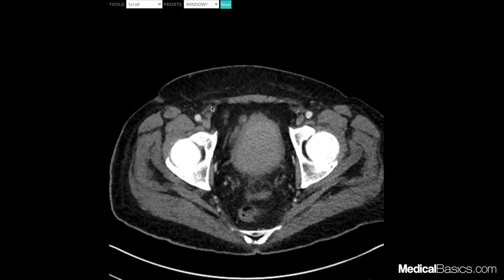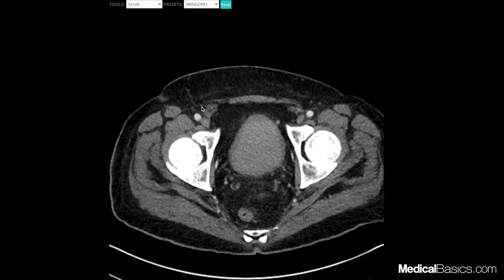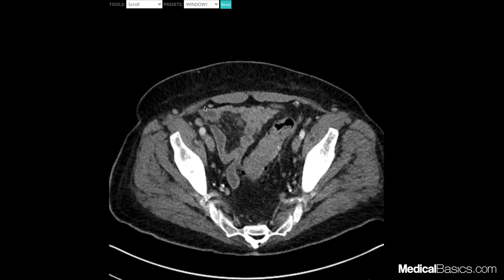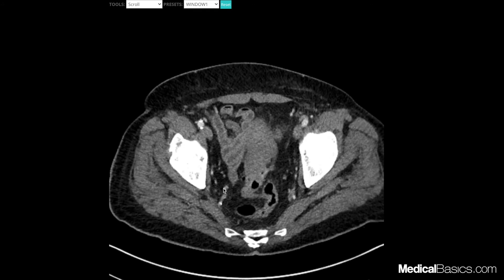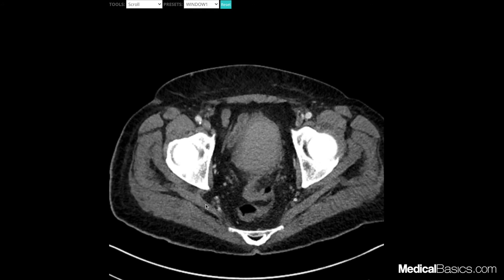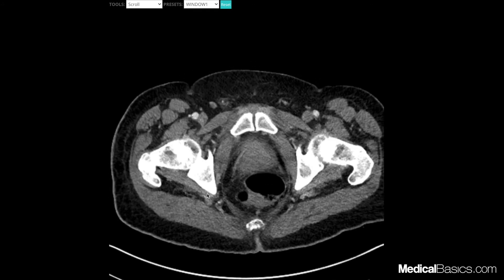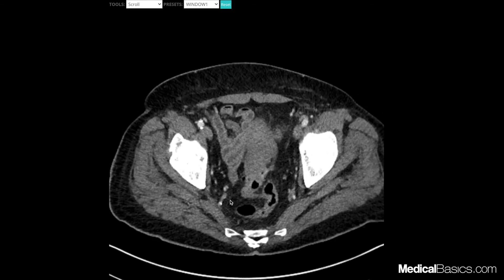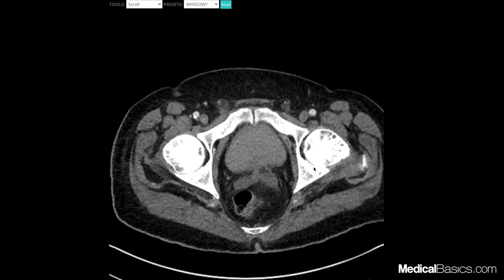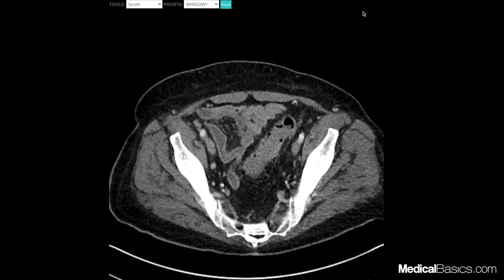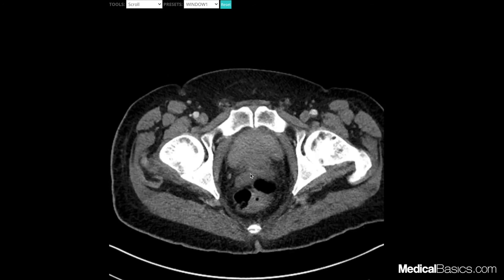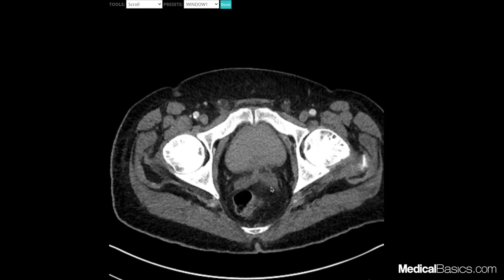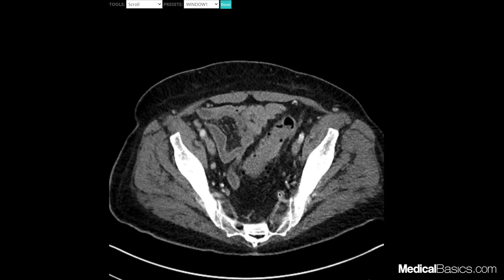In the inguinal region, I usually use a cutoff of 1.5 centimeters. In the abdomen in general, it's going to be 1 centimeter, with some variations. This is going to be our internal iliac, and while looking at the internal iliac, we look along the pelvic sidewall — especially in patients with prostate cancer or uterine cancer. Here are some small lymph nodes along the pelvic sidewall. We do the same thing on both left and right. Patients with prostate cancer, rectal cancer, or those with erectile nodules are also going to have these lymph nodes.